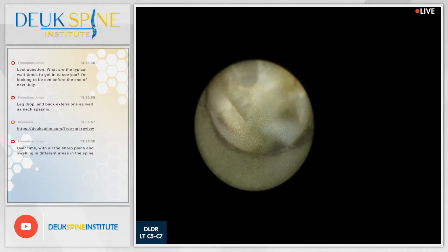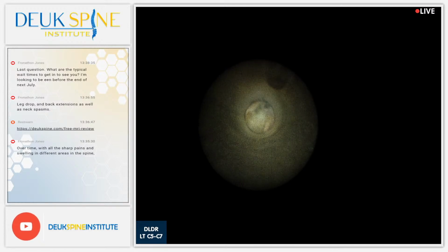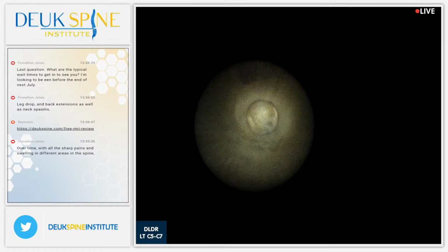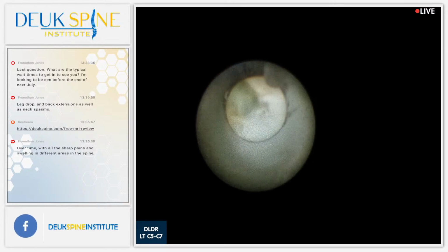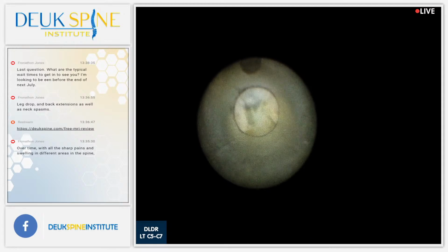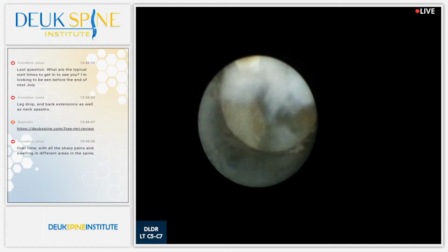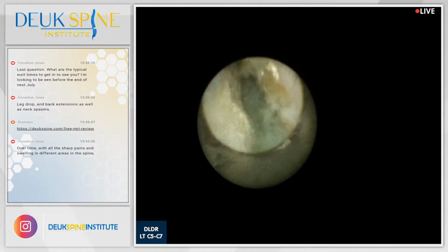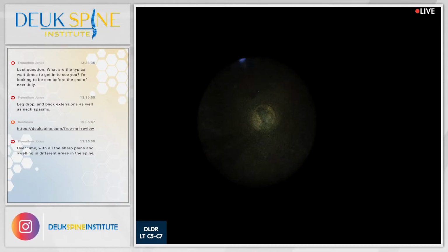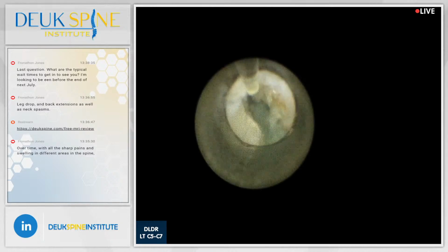I mean, Jordan, before on the MRI, it looked like a contained herniation, right? Wait, I got to go this way. Sorry, Luis, I apologize. Wait, okay, that's that. All right, so I do have to go that way. Apologize. Let's go take a look. Huh? It was contained, and now it's gone through. All right, we're almost done here. So the good news is, even though it's worse, we're almost done.